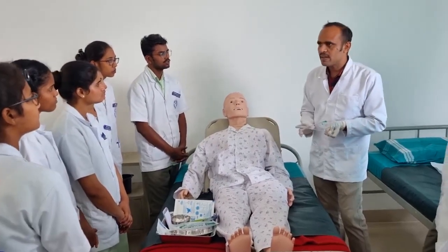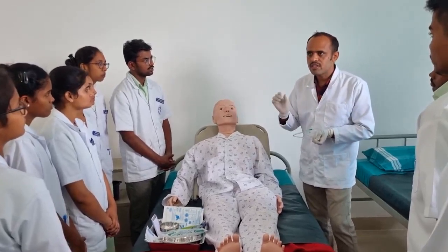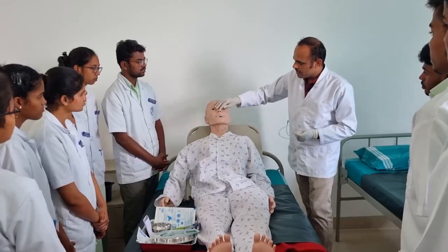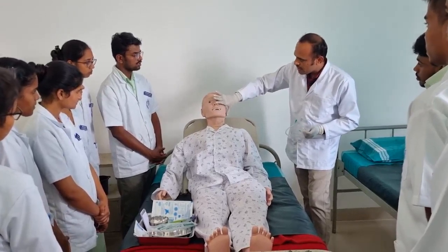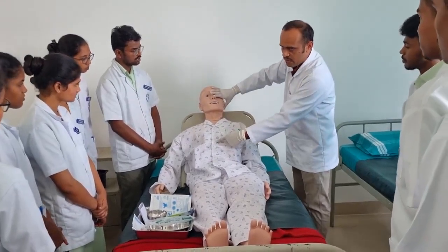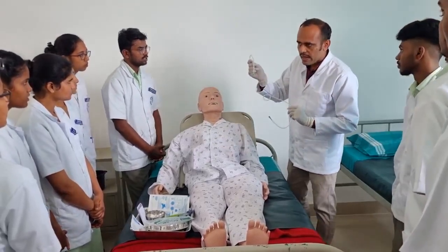Here, there is a method of obtaining the information regarding insertion of the tube. How will you take the measurement? That is from the bridge of the nose to the earlobe, and from the earlobe to the xiphisternum.